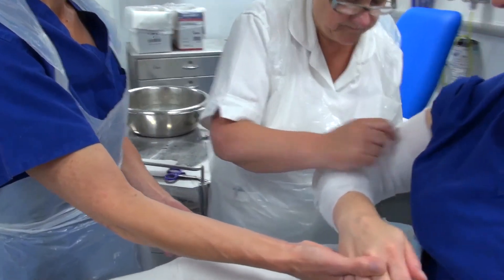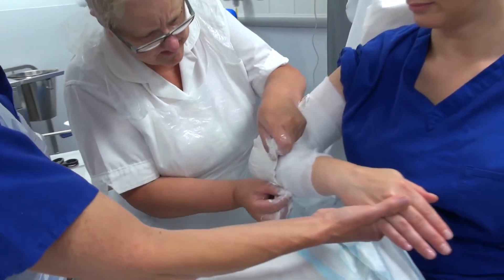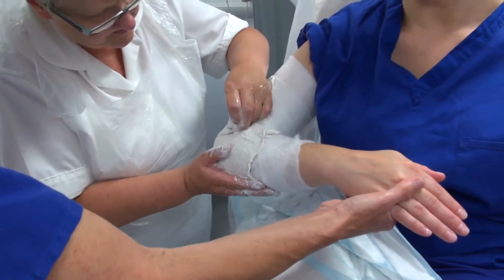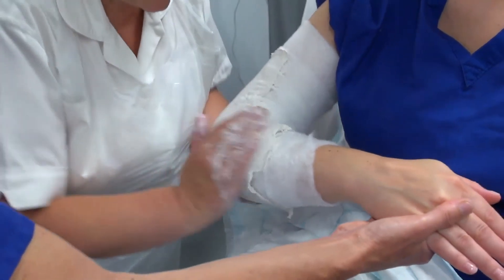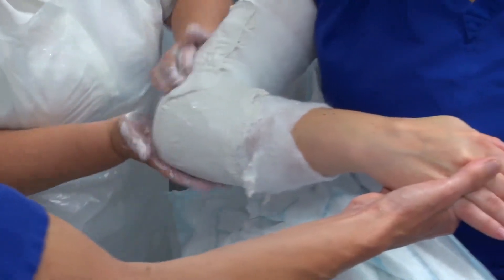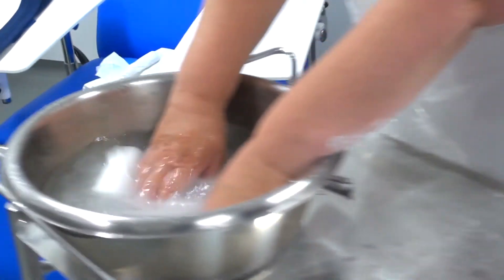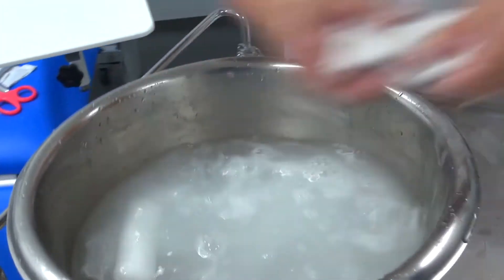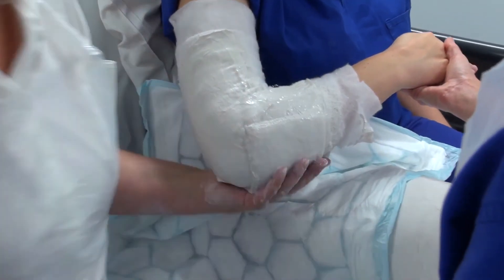I'm just applying the back slab now around the elbow, just making sure the inside of the elbow is nice and smooth so it doesn't rub or dig into the patient. I'm just going to put a wedge of plaster underneath there, which just provides some extra weight.